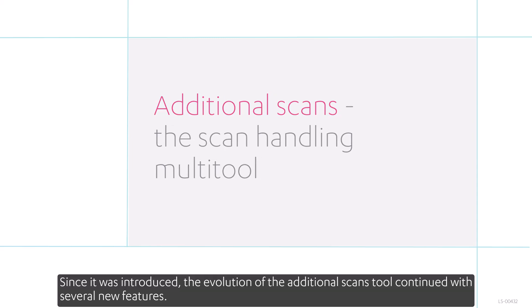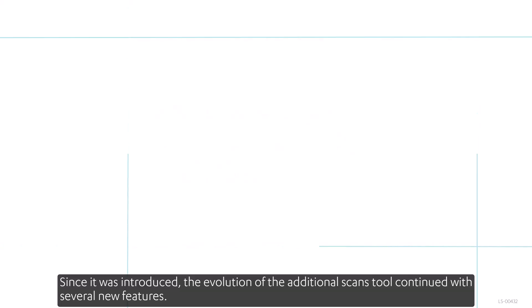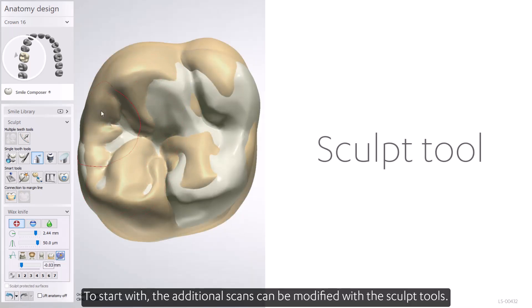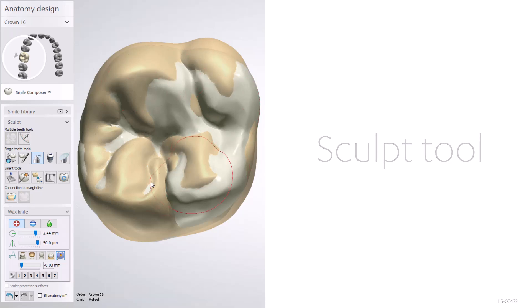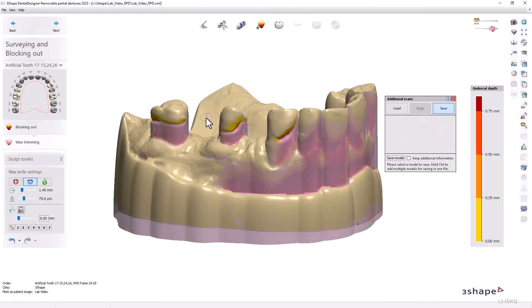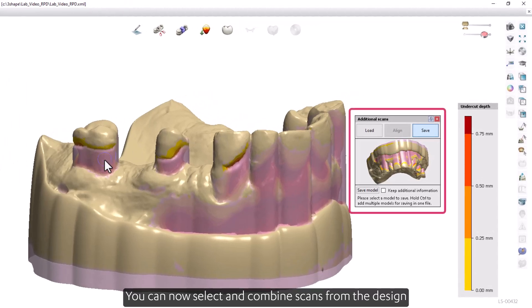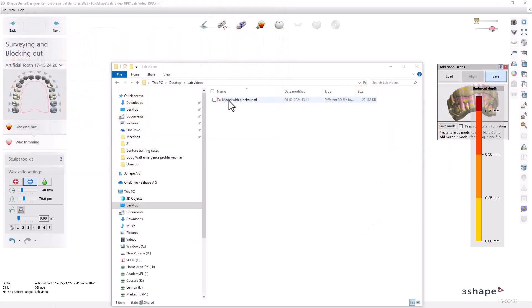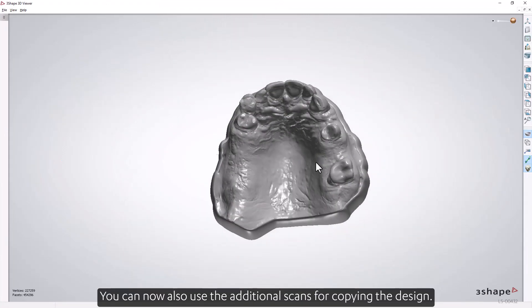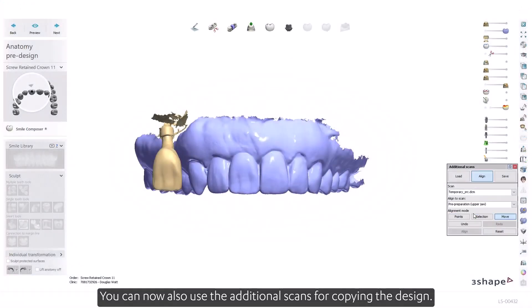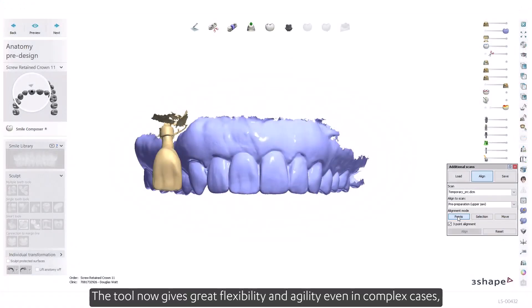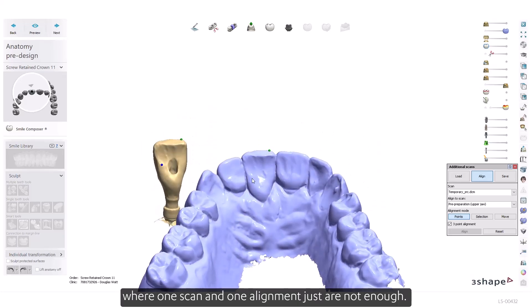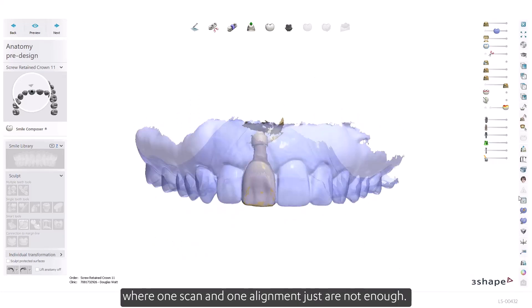Since it was introduced, the additional scans tool has continued to evolve with several new features. Additional scans can now be modified with the sculpt tools. You can select and combine scans from the design and save them in various file types, and you can use additional scans for copying the design — giving great flexibility even in complex cases where one scan and one alignment are not enough.